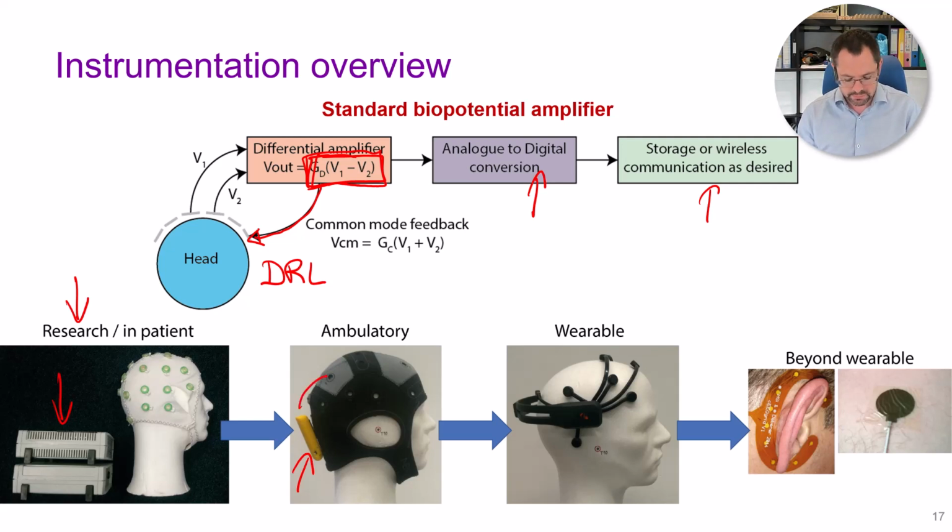That minimizes the wiring distance for the electrodes, which can help with data quality, because there's less distance for interferers to be picked up on. Fundamentally, they're small, they're portable, and people can move about while wearing them, which will lead to the introduction of more artifacts in the trace, which we're going to have to do some processing to handle.